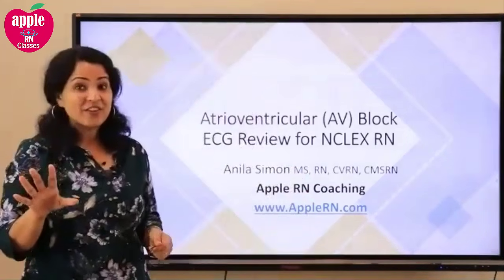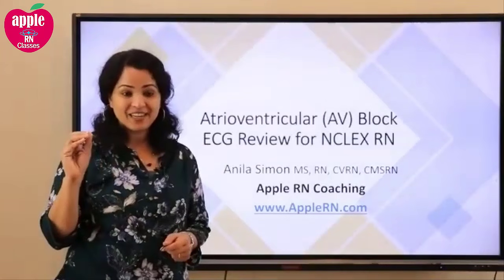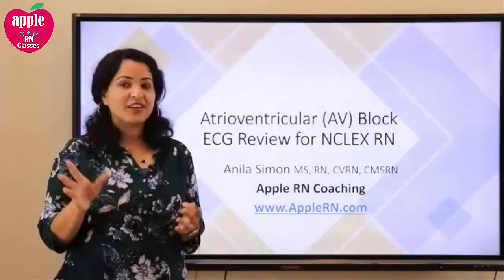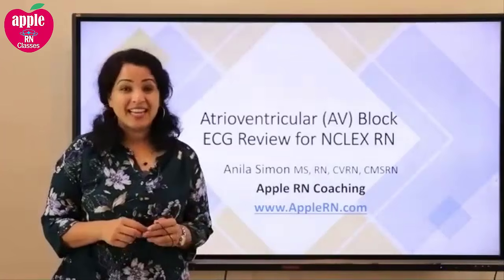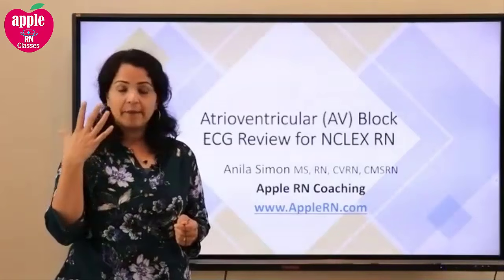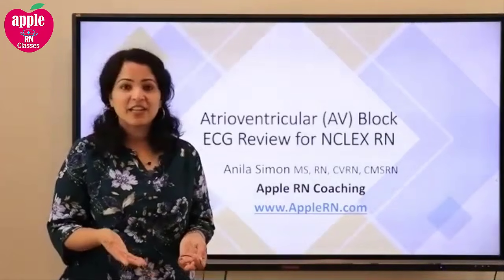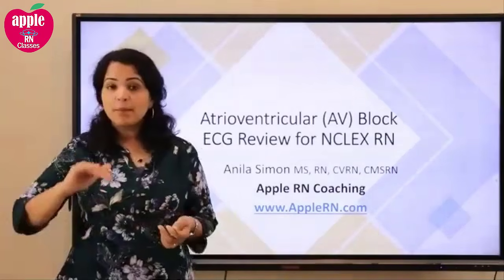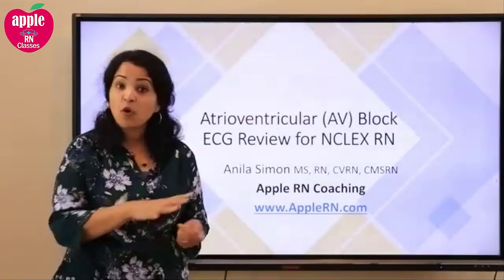Now, today we are going to talk about a very special part of ECG interpretation, and that's atrioventricular block, or AV block. There's a lot we could talk about when it comes to ECG, maybe atrial fibrillation, SVTs, VT, VFib, but we're not going to go there because that's all part of our course already.